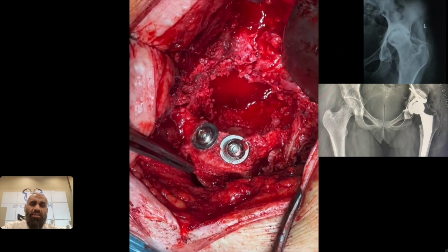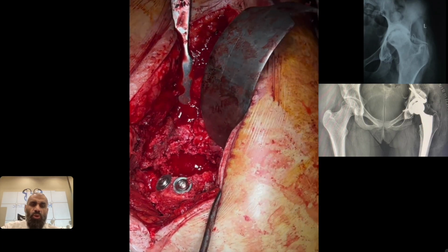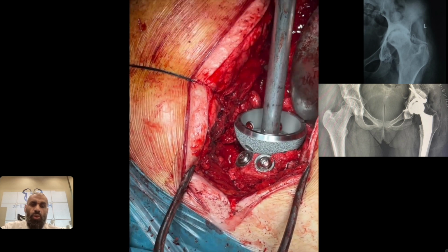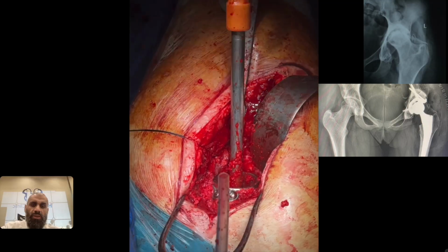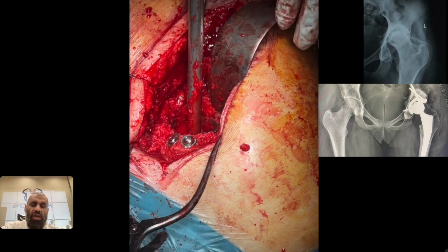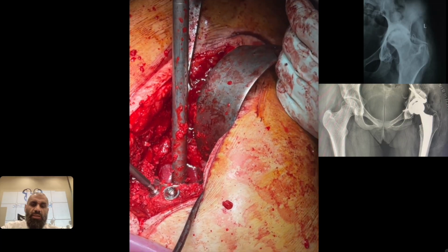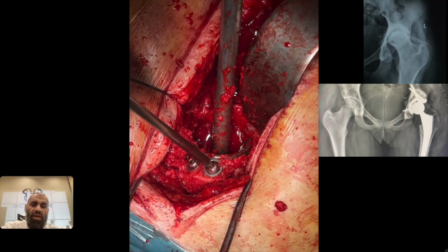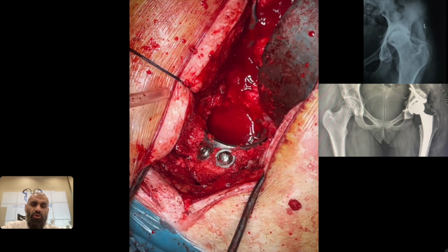To the right hand side is the anterior part of the acetabulum, and to your left hand side is the posterior superior part at the graft side. This is the 50 cup, a multi-hole cup. The cup is hammered gently and should be covered by the edge of the graft, but not too deep, so as not to compromise the structural support of the graft. Then the screws are tightened over the cup to have more compression. The handle is removed.